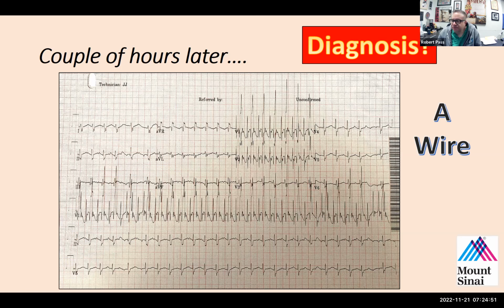hemodynamically stable, you could check the sensitivity on the pacemaker, but it was at its most sensitive setting. So even at the most sensitive setting, it was occasionally undersensing, which was likely the etiology of the iatrogenic atrial flutter. And so we elected to leave the patient in junctional rhythm in the high 100s and teens, and the patient was very stable and did well. And when the chest was closed, we asked that the surgeon place a new set of atrial wires, which they did. So the patient did very well.